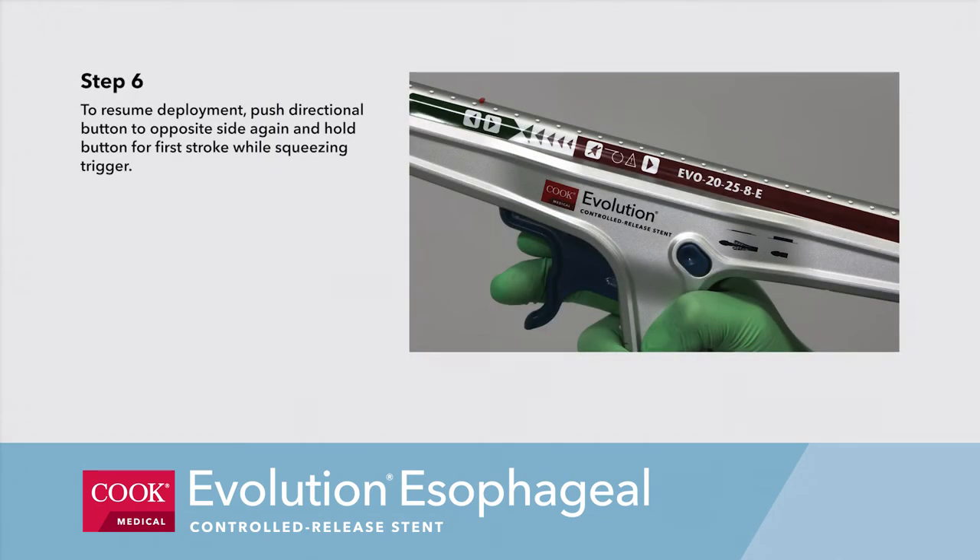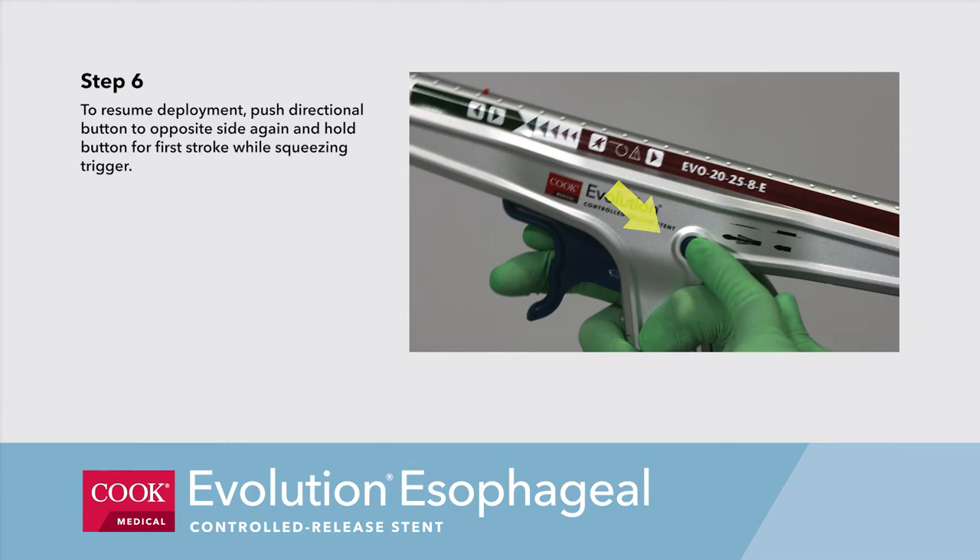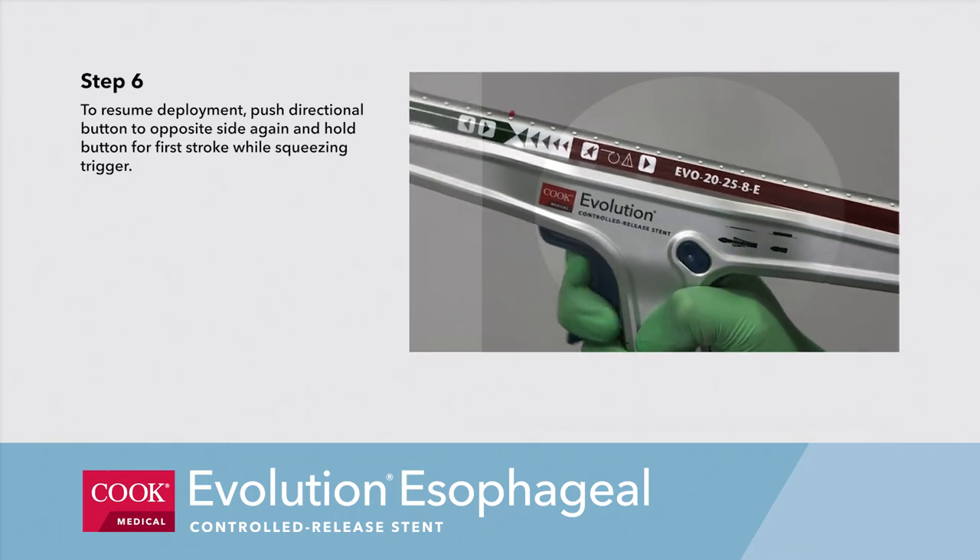Step 6b. To resume deployment, push the directional button to the opposite side again and hold the button for the first stroke while squeezing the trigger.